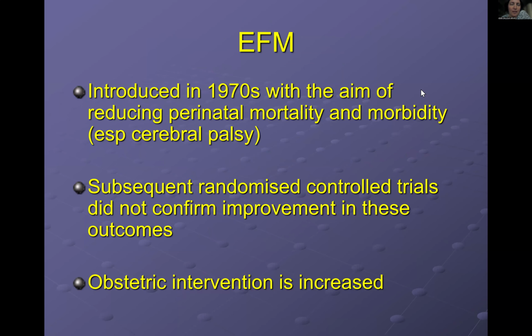Rather than just listening in intermittently, you have a machine which can monitor more objectively, rather than relying on the midwife or the obstetrician listening in, by having a printed trace. The aim was to reduce perinatal mortality and morbidity, especially cerebral palsy, so to have safer births for babies.